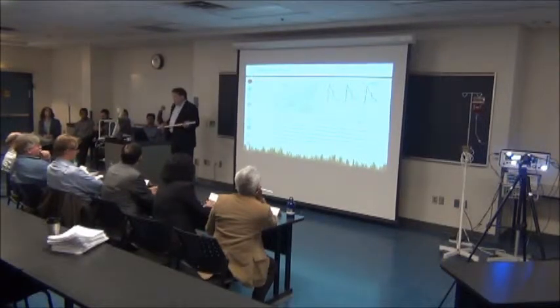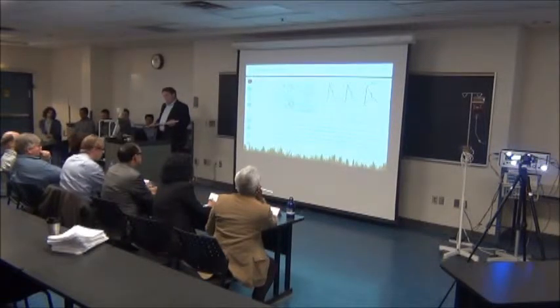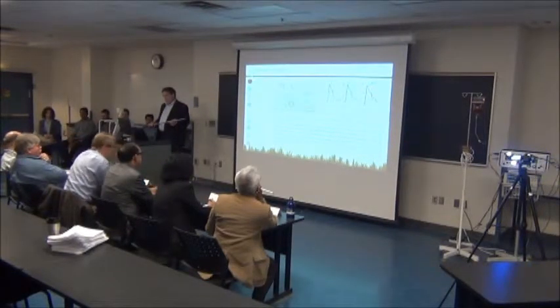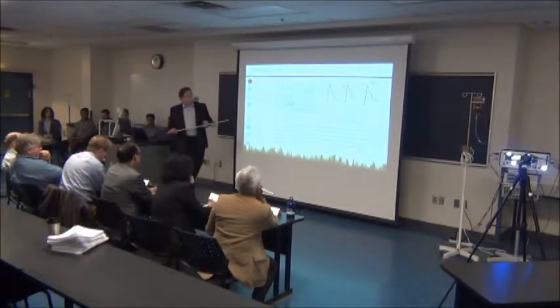Calibration, zero. A pump and pressure gauge can be attached to the transducer for calibration. If 0 millimeters of mercury is applied, the transducer being essentially open to the atmosphere, the transducer will probably not produce 0 millivolts. It will produce a small voltage, like an offset, for example 1 millivolt, which will be amplified to a larger voltage and displayed as a line, for example at 10 millimeters of mercury. The line has to be brought down to 0 using a zeroing knob.